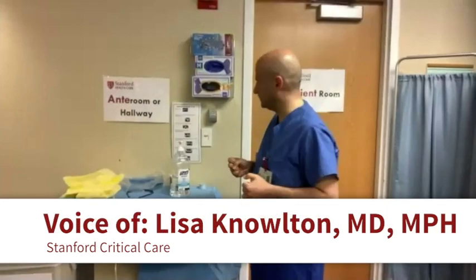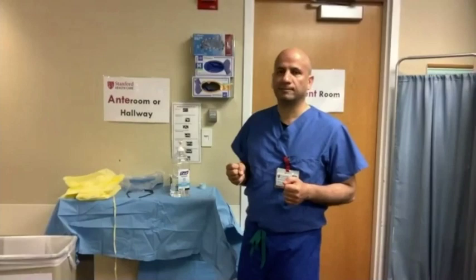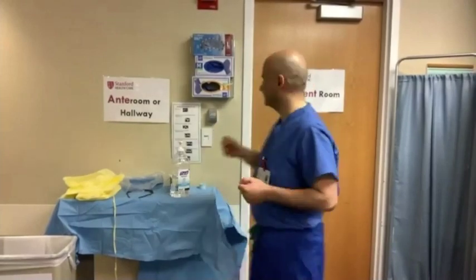Good morning, everyone. We're going to start with the donning of PPE process first. You can imagine that you're outside of the patient's room right now, or in the anteroom.